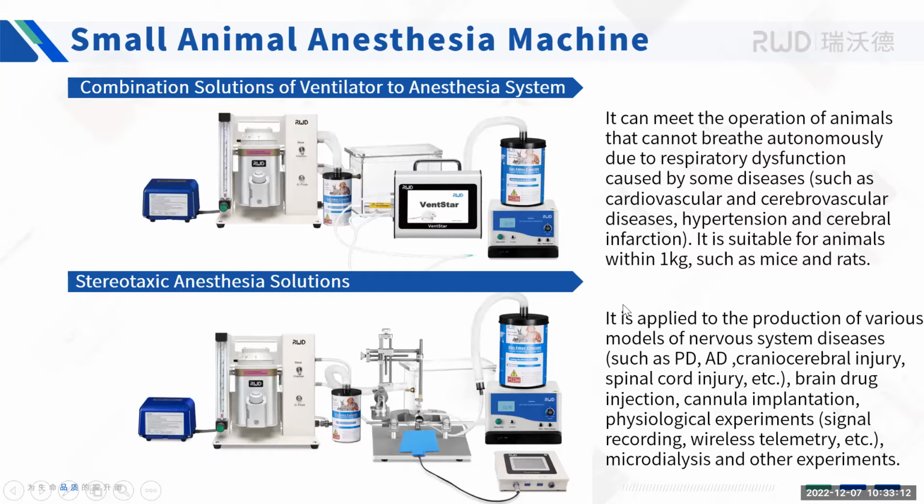And these are 2 solutions that Chloe has mentioned. We can use it with the ventilator together if the animal is not breathing well. When we use the ventilator, we should change the mask to this endotracheal tube. When we connect the anesthesia machine with the ventilator, the anesthetic gas will go into the animal through this endotracheal tube. And for the waste gas, we should use the gas recovery system.